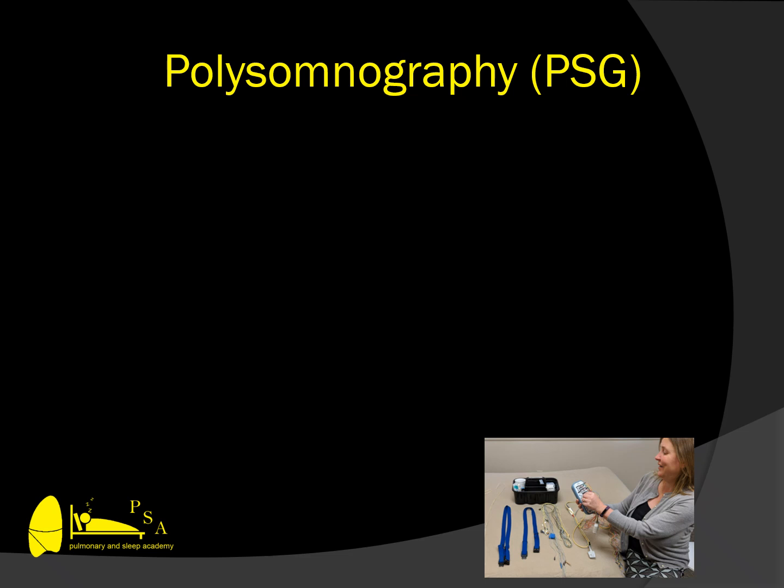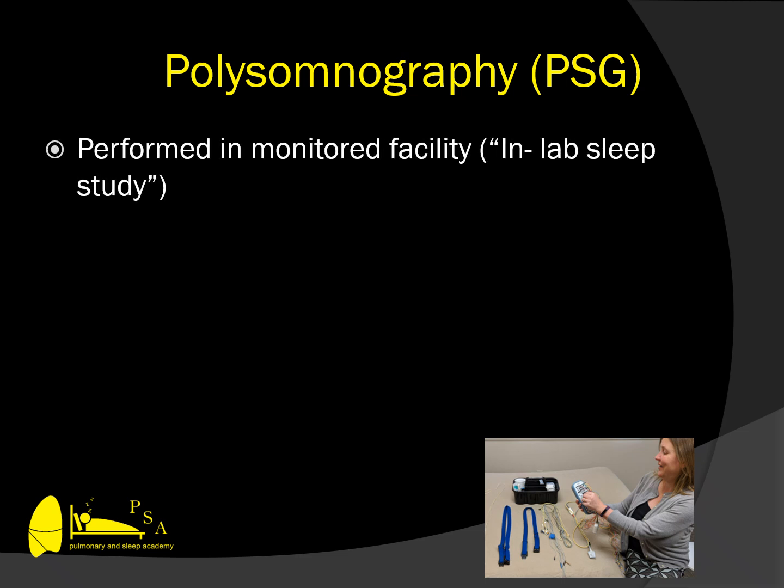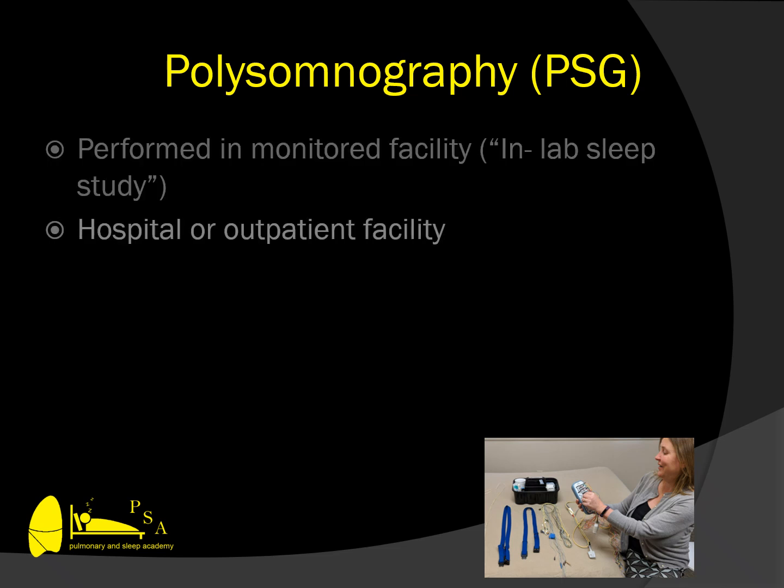So the first study I'm going to talk about is the polysomnogram, the PSG. This is the traditional study over the past 20 to 25 years that most people have referred to when they say, I had a sleep study. The study is performed in a monitored facility. There is a technician who is monitoring the patient while the recording is taking place. Often this is referred to as the in-lab sleep study.